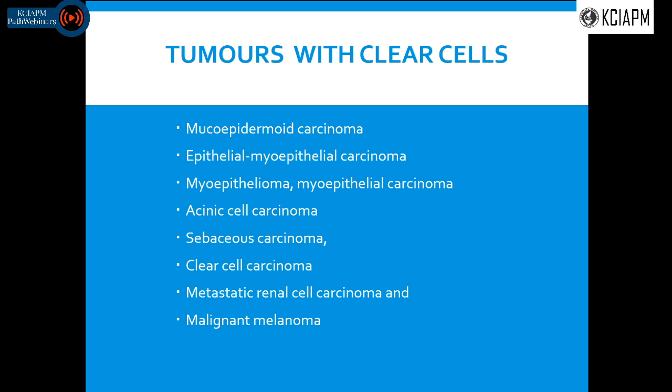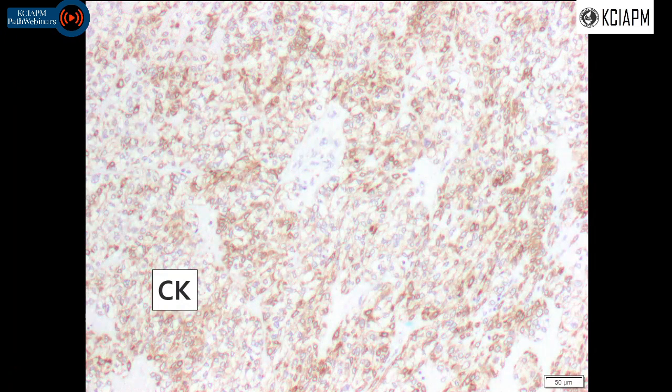So what do we have? Is this a metastatic lesion? Epithelial, so it's a metastatic carcinoma. But looking through the diagnoses that one could think of with clear cell malignant tumors in the bone, say in the head and neck region, they start from mucoepidermoid going up to the clear cell variant of malignant melanoma. So the way to go about it, yes, we start with the immunohistochemistry.